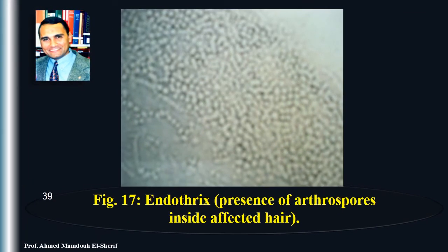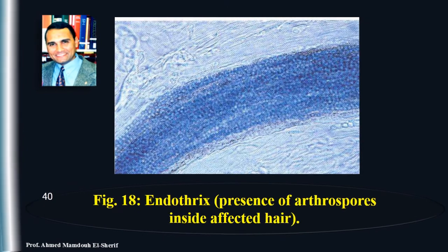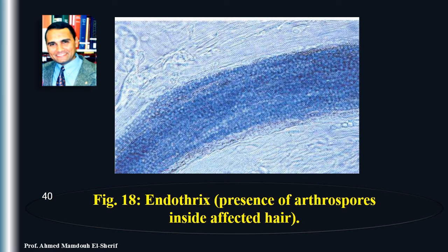This is the shape of endothrix, which means presence of arthrospores of the fungi inside the affected hair.